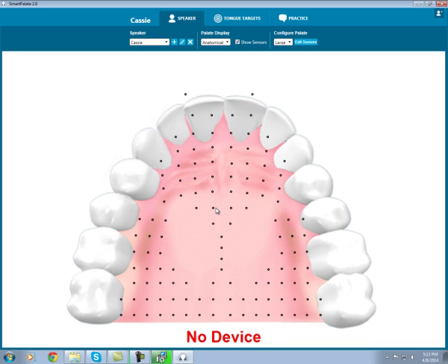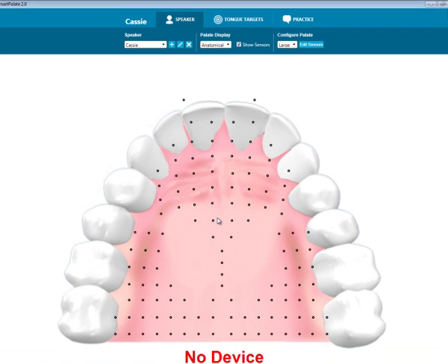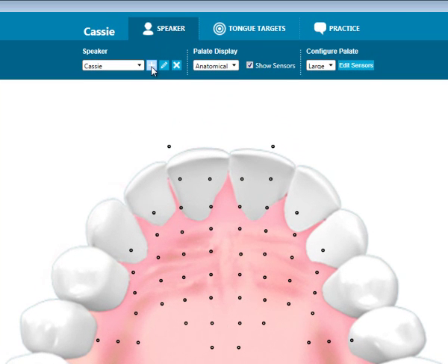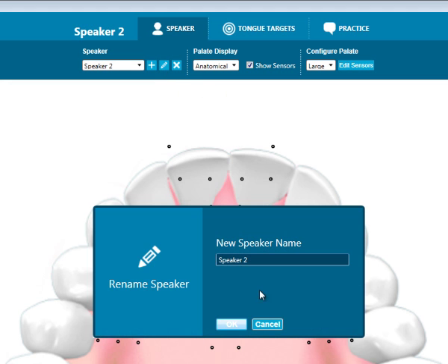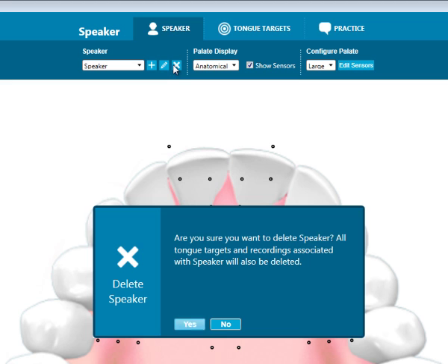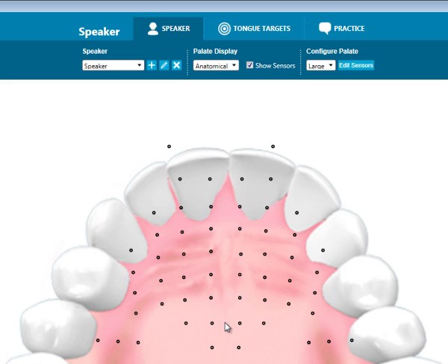Here in the speaker tab, you can make changes to the speaker display. To create a new speaker, once you are in the software, you will hit this plus sign. Give your speaker a new name and hit OK. You can also edit the speaker name and delete a speaker here. To switch to a new speaker, click this drop down and select the speaker you would like to work with.